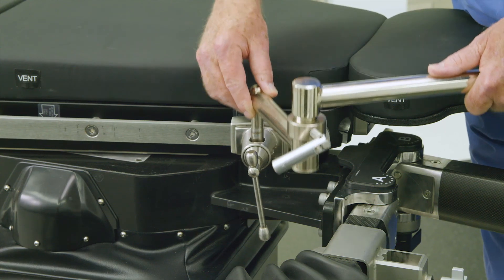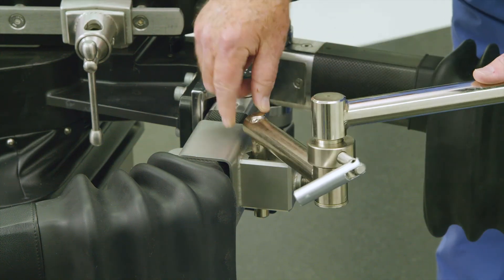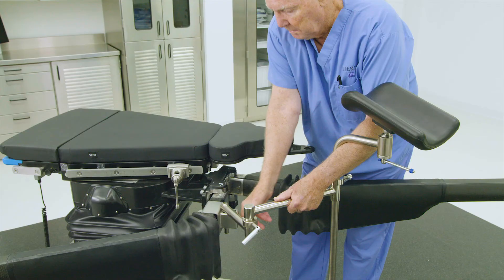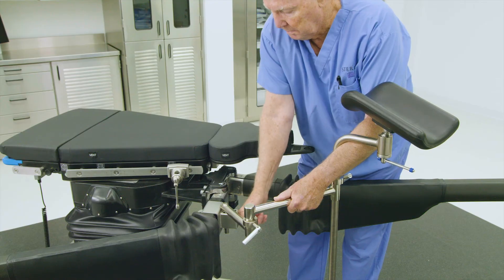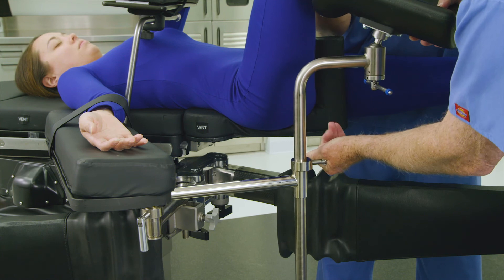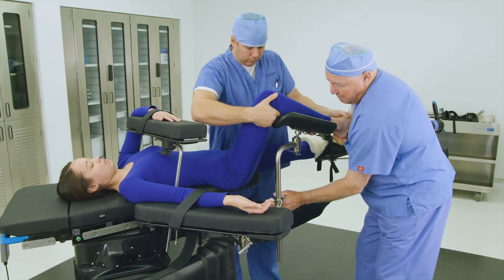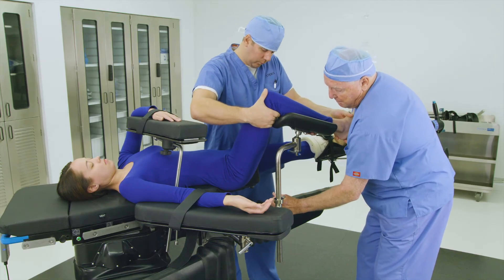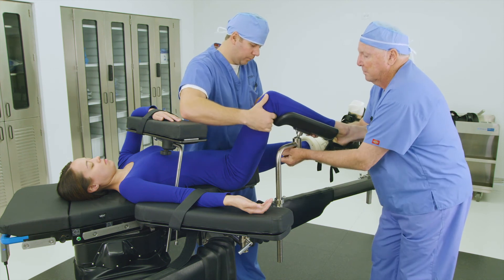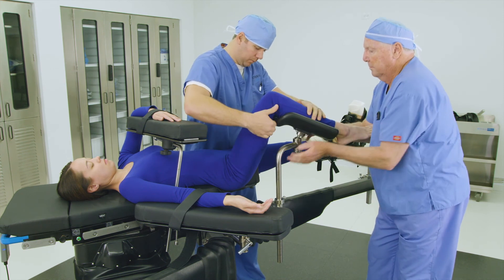Place the socket post in the socket clamp or the spar clamp and tighten down the respective handle to secure. Use the adjustable joints of the articulating universal leg holder to position the device appropriately for the patient's non-operative leg. Ensure all connections are secured before placing the patient leg in the holder.